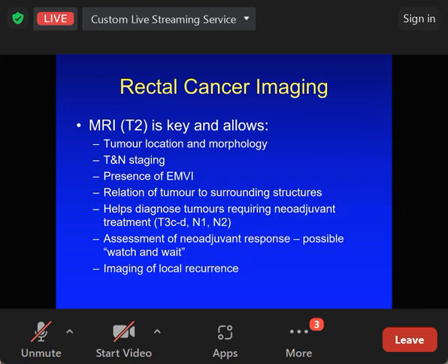Like small bowel obstruction or large bowel obstruction? No, I would advise against it because you would use water-soluble contrast, and in obstruction, generally there'll be a lot of fluid in the abdomen, within the bowel.